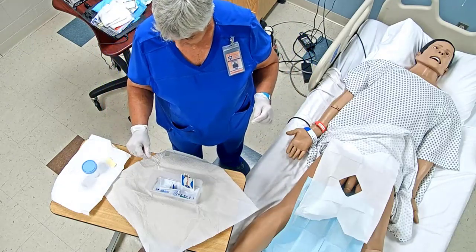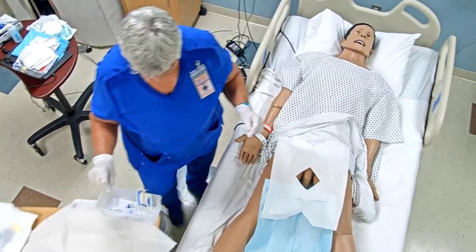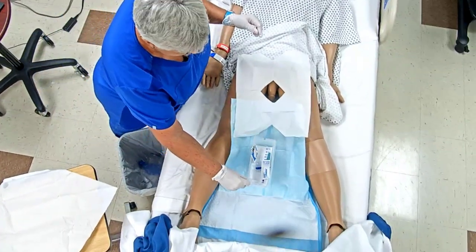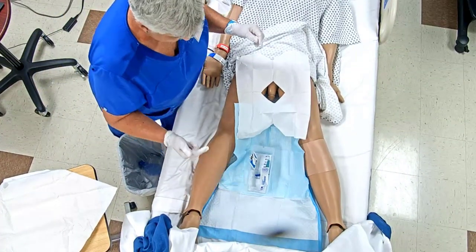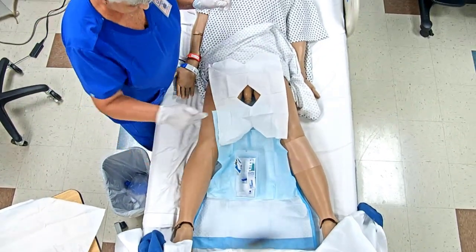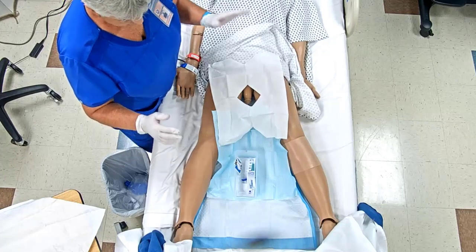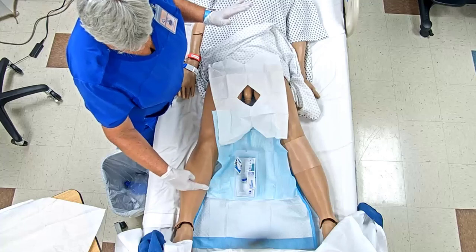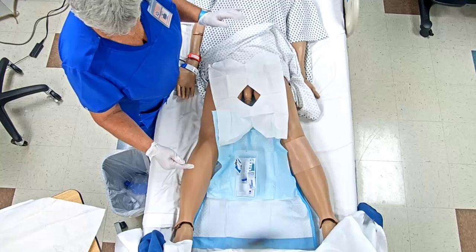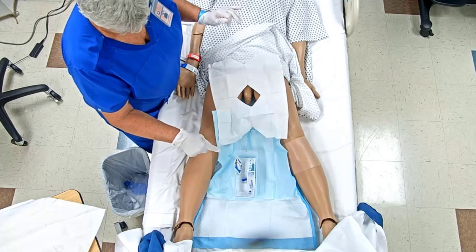Okay, so I've got everything ready, so I'm going to go ahead and take this. Just going to move that out of the way, get my trash over here, and I'm going to set this down, okay? Making sure that when I do, the 1-inch border around my field doesn't come in contact, okay? Now, I'm going to designate, now you see that it is on the 1-inch border down below, but what has to stay sterile is inside my container, okay?